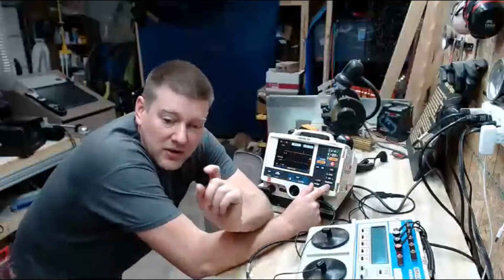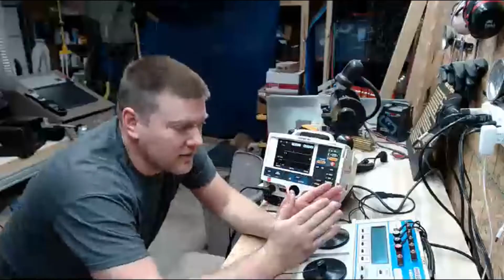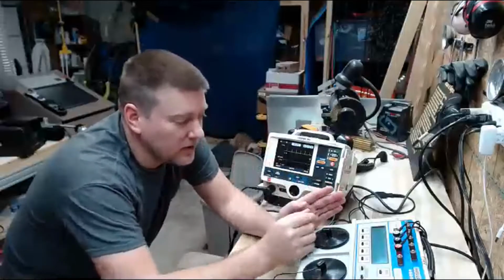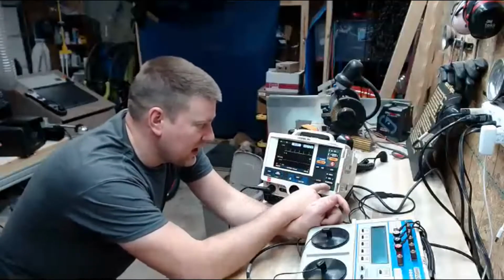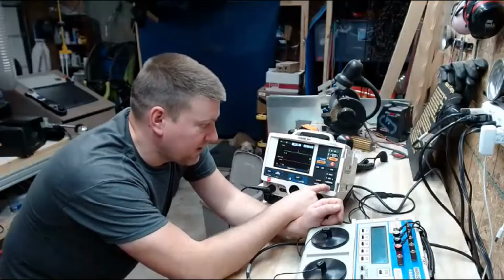So the pause is doing a 1 in 4. A 1 in 4 means that for every 4 beats that you tell it to do, it's going to do 1 pulse. And when you release the button, it goes back to its regular rate. I have it set at 100 ppm, so 1 in 4 is basically 25 ppm.